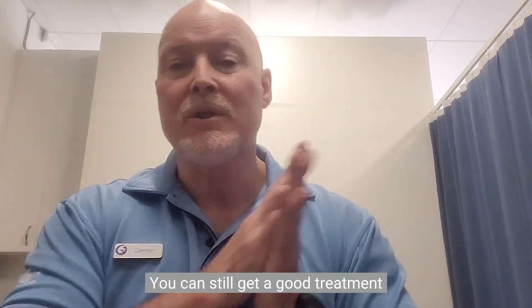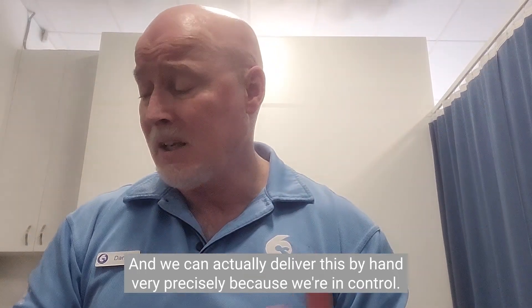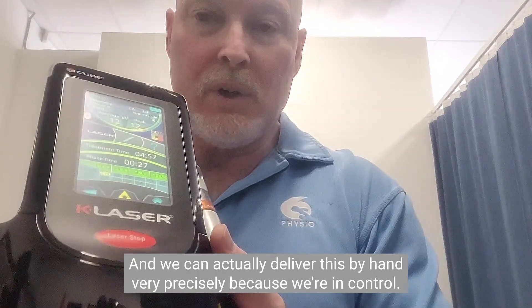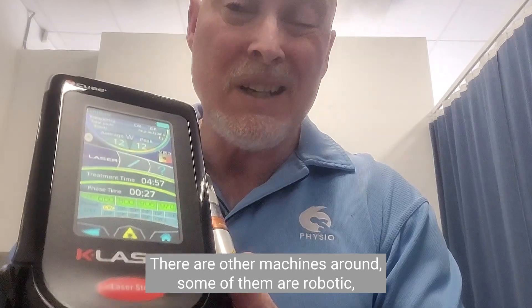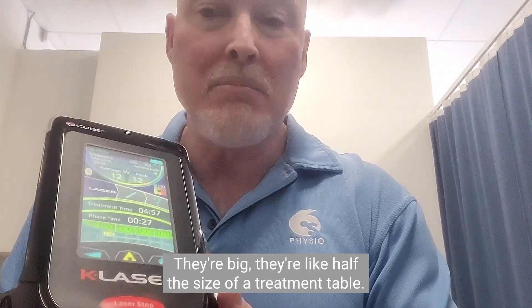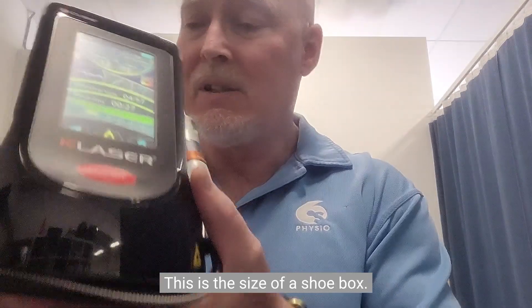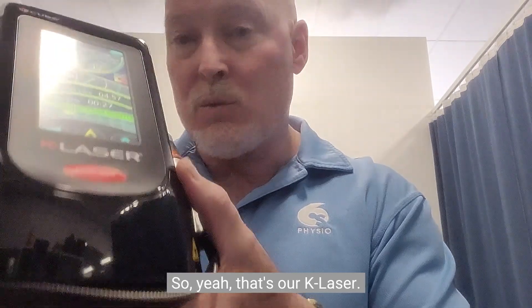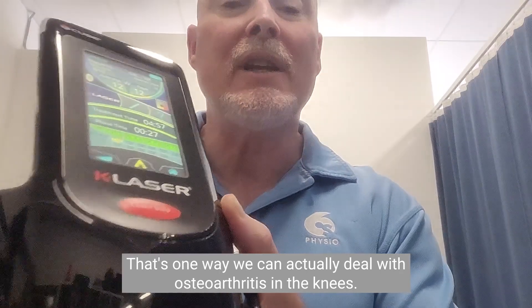You can still get a good treatment with a 3B laser but it does take a lot longer. We can deliver this by hand very precisely because we're in control. There are other machines around — some of them are robotic, so they're actually programmed and take a lot longer to set up. They're big, like half the size of a treatment table, whereas this is about the size of a shoebox. So that's our K-Laser — that's one way we can deal with osteoarthritis in the knees.